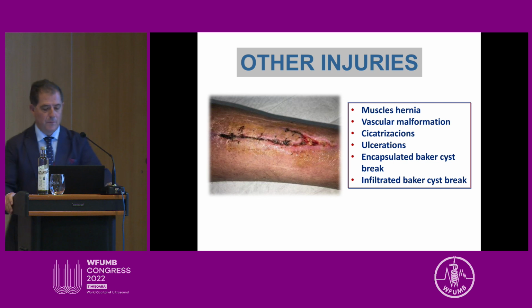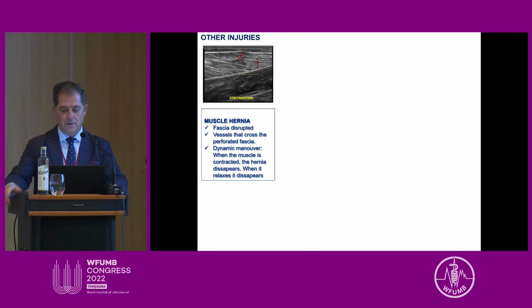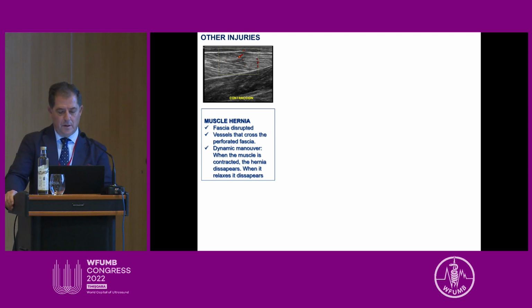Finally, we don't have more time, but I only want to comment on the possibilities that the ultrasound gives us to diagnose other injuries. It's a pity because this video doesn't work.